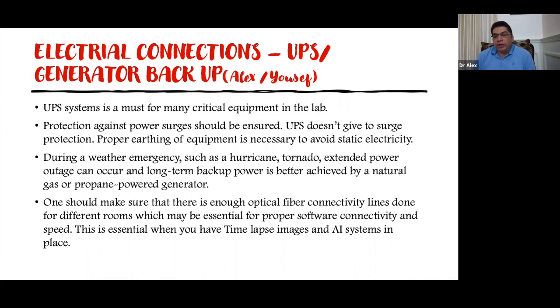So every major equipment should be connected to either a UPS or a generator. When it comes to UPS, there is another issue. I can tell you an incident. There is one clinic of my friend. He was doing some FETs for a particular few weeks, and the FET outcome was negative. When they did the troubleshooting, they found that the box incubator was connected to a UPS, and there was no surge protector.